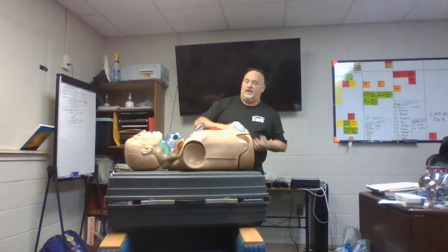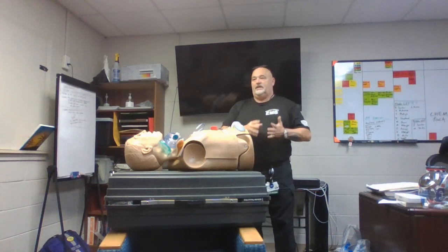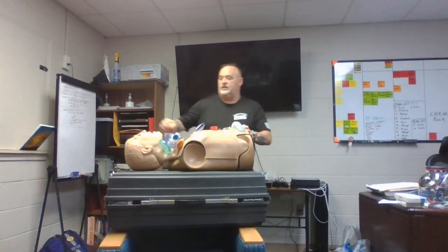Bevel to the septum, lube it, we put it in, and you'll feel it slide all the way down, and it'll sit at the base of the nare. So everybody, and I say this because I've seen it on numerous occasions, ALS providers, we get so in tune with, they're clenched, I can't get a tube in.